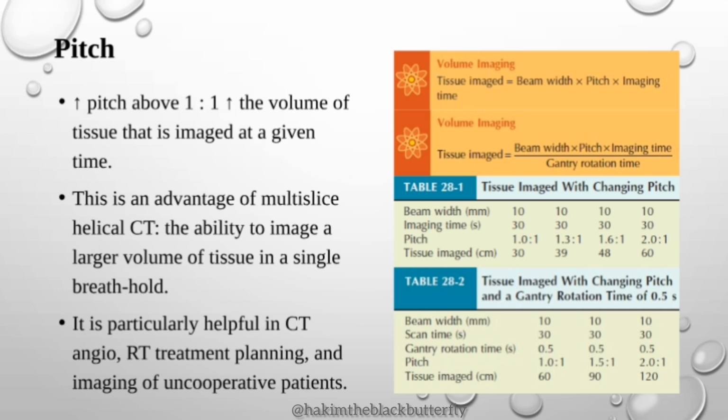As the pitch increases above 1, the volume of the tissue that is imaged at a given time also increases.